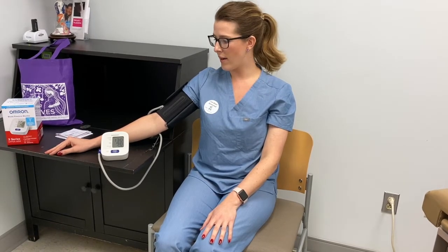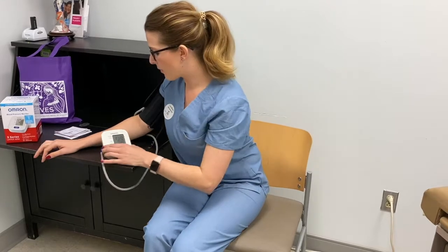This is a good time to talk about why we check your blood pressure in pregnancy. A, we want to make sure that you and your baby are safe, and B, elevated blood pressure can be a sign of preeclampsia. So if you get numbers that are greater than 140 over 90, we definitely want you to let us know. All right, so my blood pressure is 138 over 98, so I would need to call and let the clinic know.